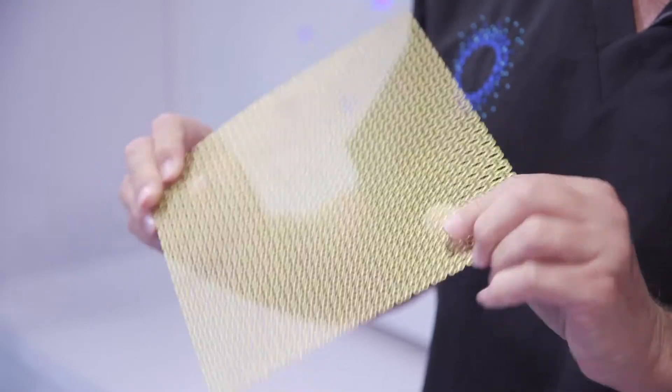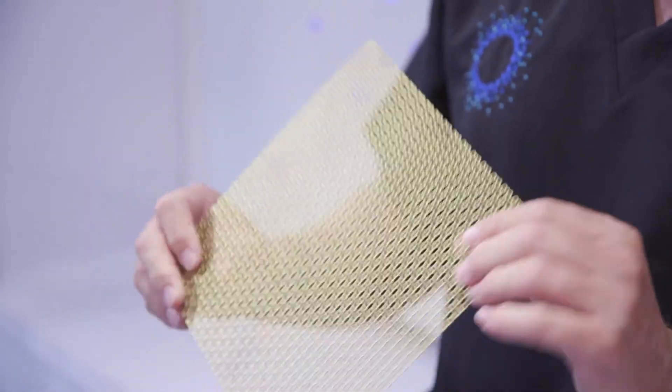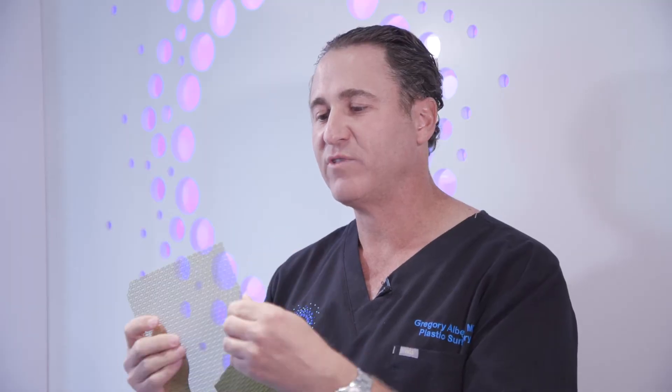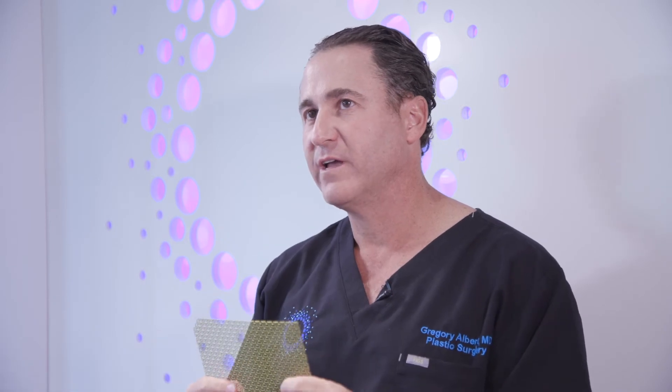The mesh we use for most reconstructions is a titanium mesh that's about a millimeter thick. It's pliable enough that I can contour and mold the floor of the orbit, which has a slight concavity, or bend it to make the bridge of the nose, or use it for the cheekbone for stability. It gets screwed in with different size screws.